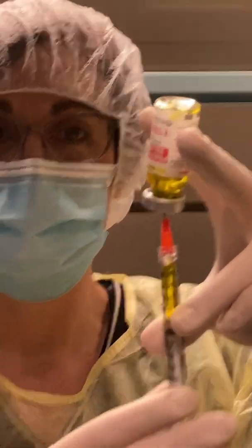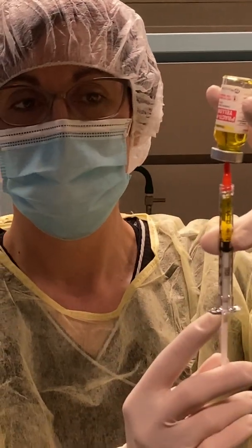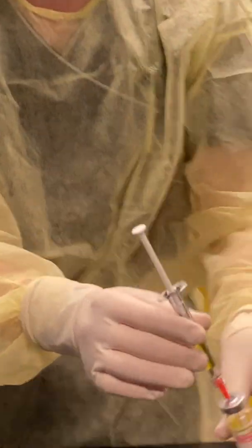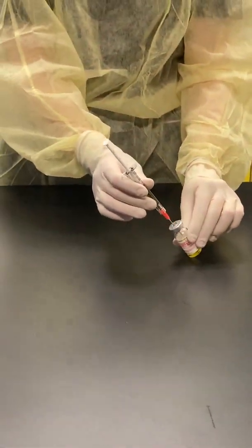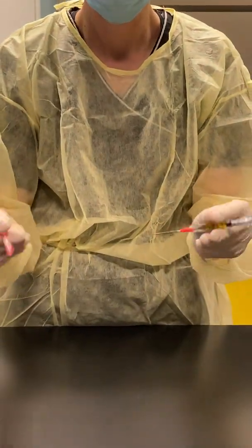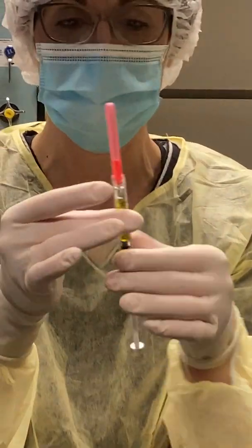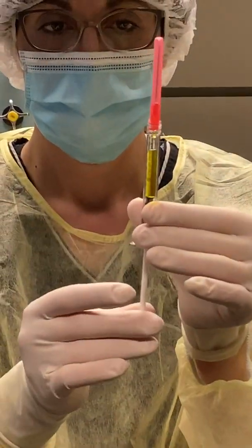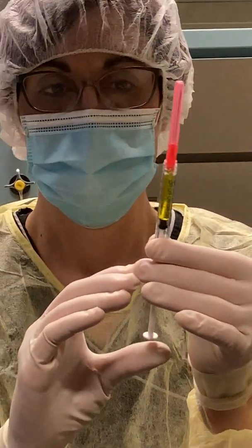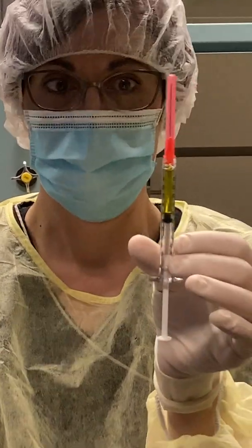To prevent any spraying in case the pressure wasn't equalized in your vial, you can draw up some air into your syringe. Put your syringe back on the work surface and remove it from your vial. Then with your needle cap, push it back up, moving the air back past your 0.5 ml.